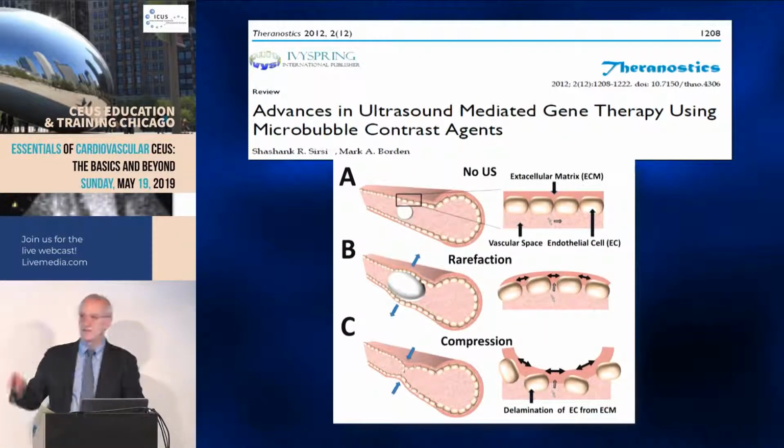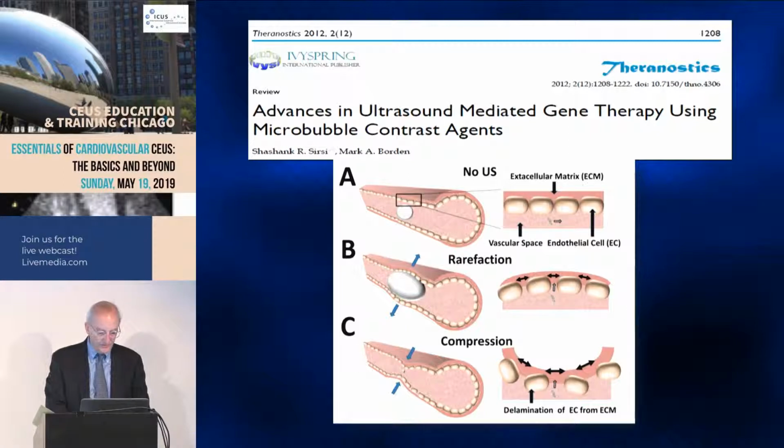So what is going on inside the little capillaries? You see this? When the ultrasound beam squeezes a bubble and then relaxes, compression and rarefaction, the walls in your capillaries don't like that. It's like you're pushing up against, now you're pulling back, pushing up. And what happens, you can see here that the cells lining the wall don't like that, and they begin to open spaces. Well, by doing that, you can get your material in. So you needn't always do what we call cavitation or disruption. You can do stable vibration. That is, vibrate like this. You know, it's like someone putting against your arm. You finally let them in the door, or you can just pop them once and break the whole wall.